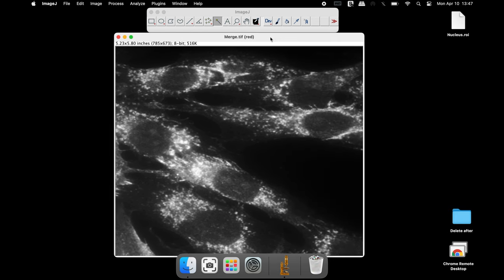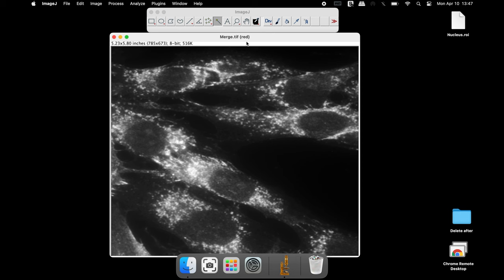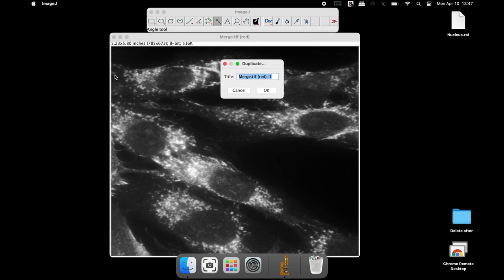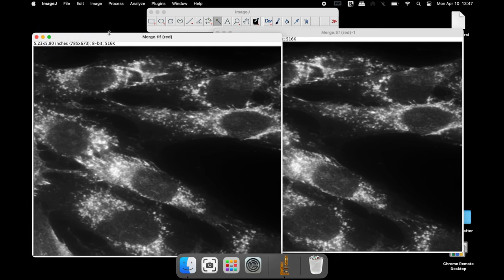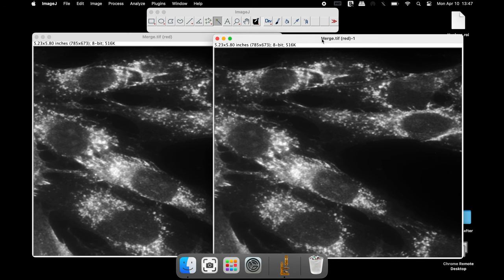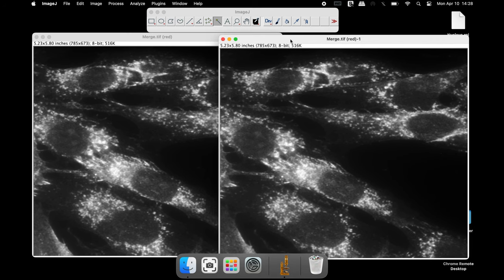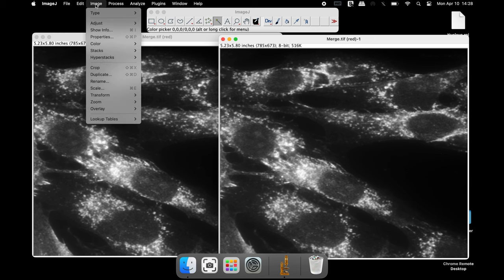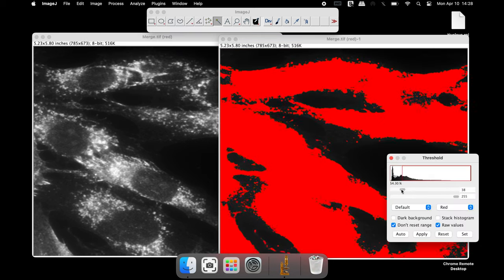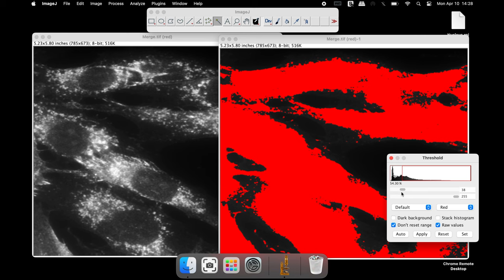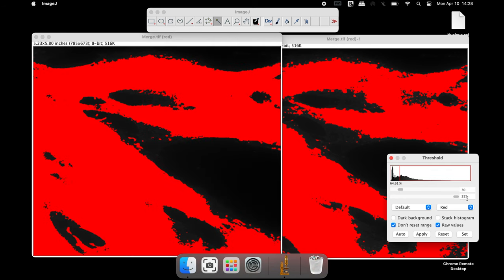Select the red channel and duplicate the image, since we require two images: one for analyzing the nuclear intensity on the right hand side, and the other for cytoplasmic staining intensity on the left hand side. Adjust the threshold in both images such that the foreground is completely red in color with a dark background.